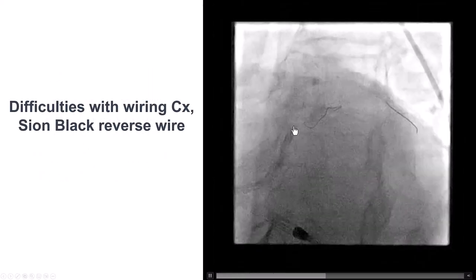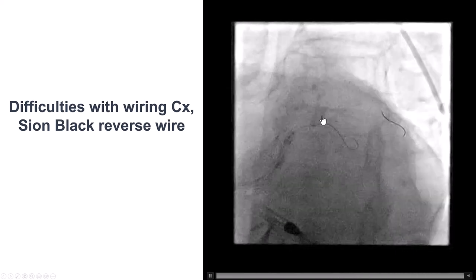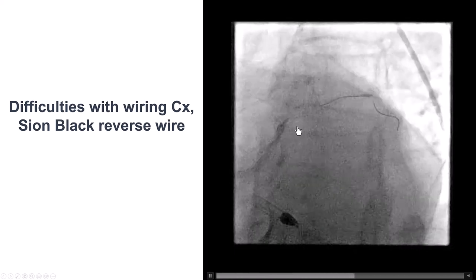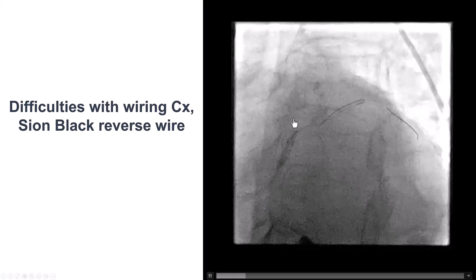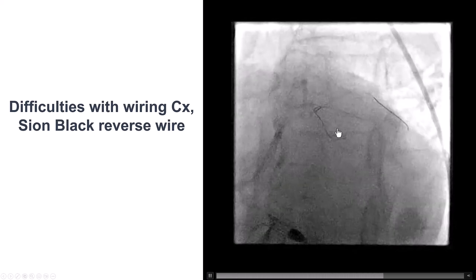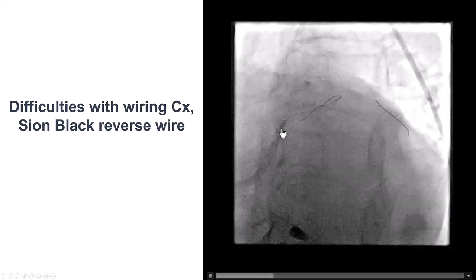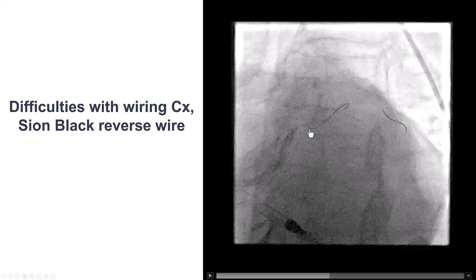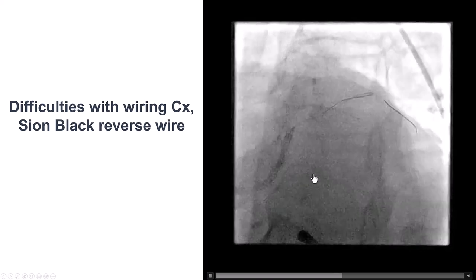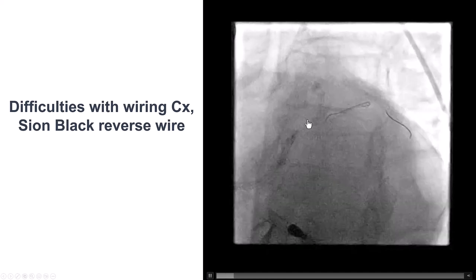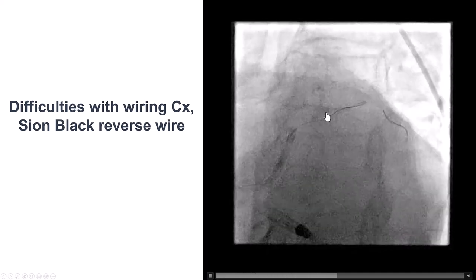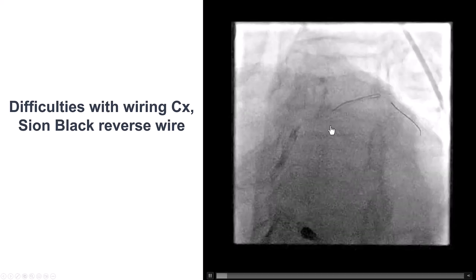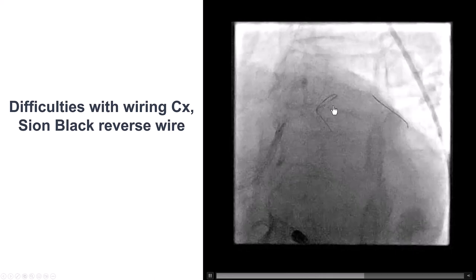The next step was to wire the circumflex. Antegrade wiring was attempted but failed due to the fairly acute angulation. After multiple attempts including using a dual-lumen microcatheter, the reversed guidewire technique was used. A Sion Black guidewire was folded over approximately three centimeters from the tip, creating a knuckle. The wire was introduced into the guide catheter with the knuckle going forward rather than the tip. Using a dual-lumen microcatheter (the Sasuki) to deliver it into the Ramus branch, the wire was manipulated back and forth, and the loop successfully selected and entered the circumflex.